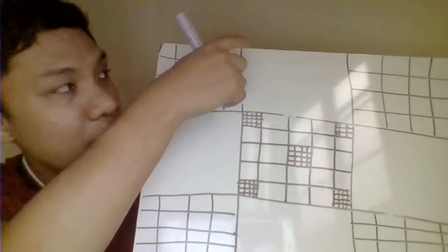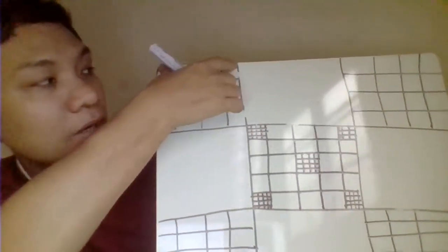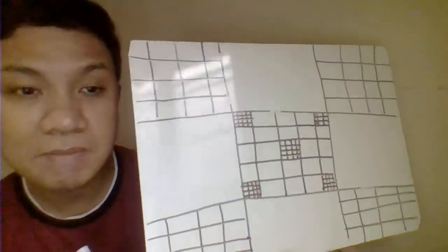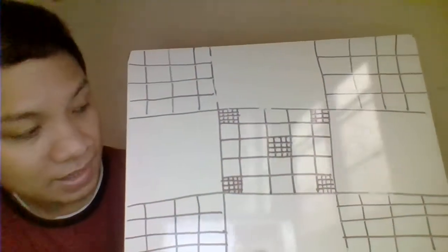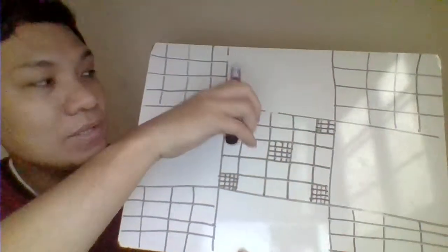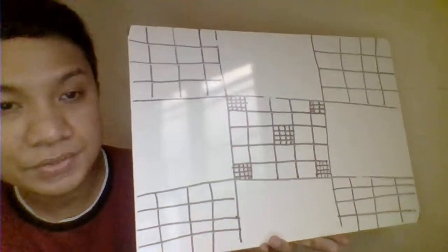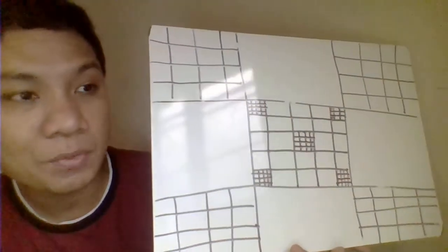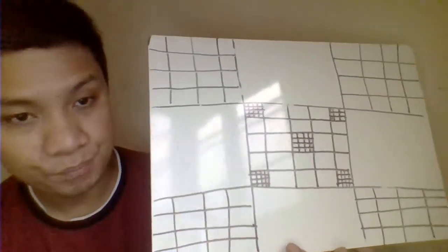Each of the large squares is 1 millimeter. So 1 millimeter, 1 millimeter, 1 millimeter, that gives you 3 millimeters for the width. Our length is also 3 millimeters, and the width is also 3 millimeters. So each of your 9 squares measures 1 millimeter by 1 millimeter.